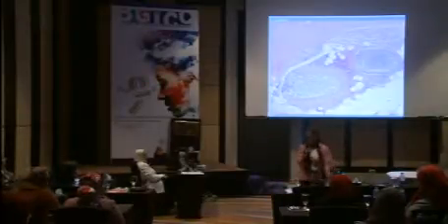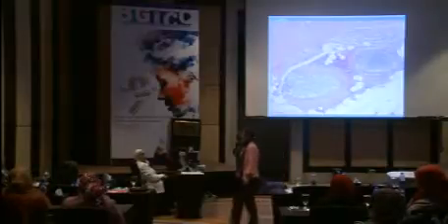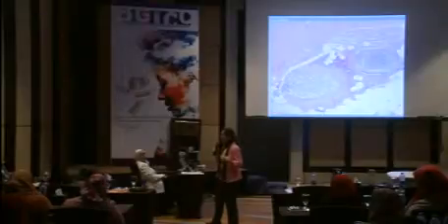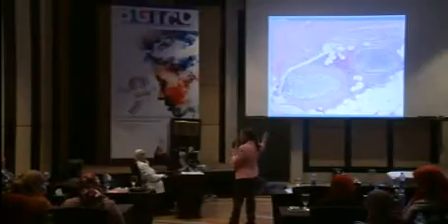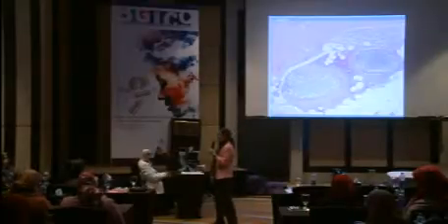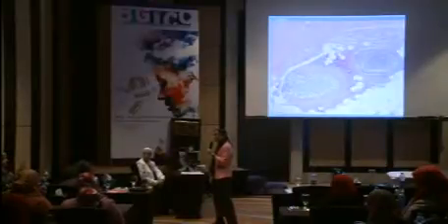There is on this one, there is invasion, yes. You mean multifocal based on mammographic findings, or on the slide you say over here, over there, over here? Okay. Frozen? We usually don't do frozen for these lesions.